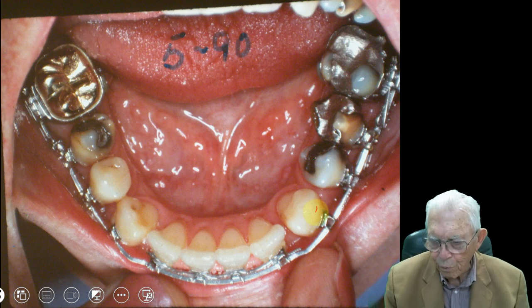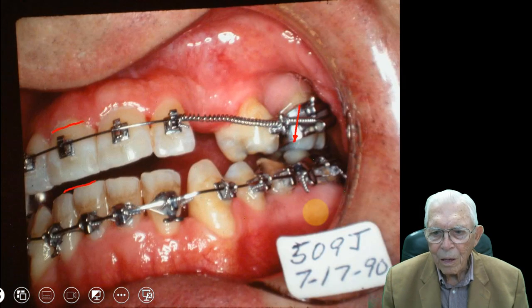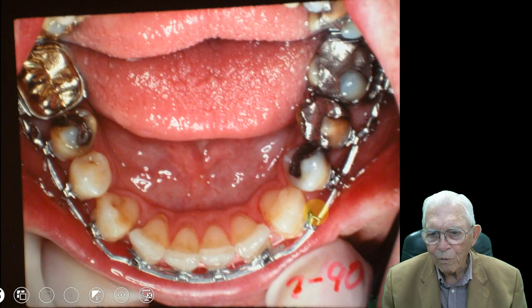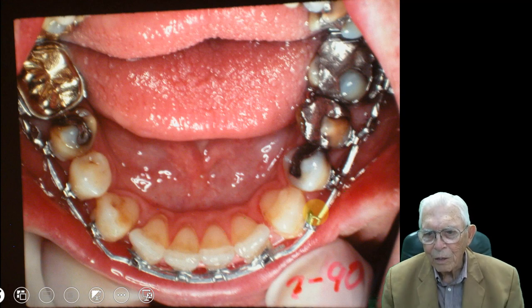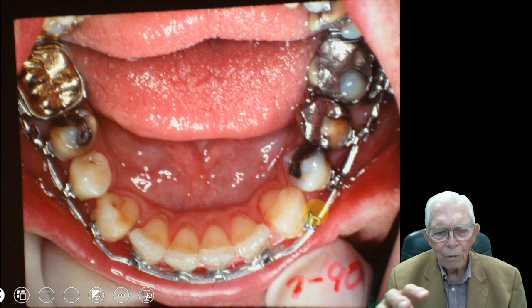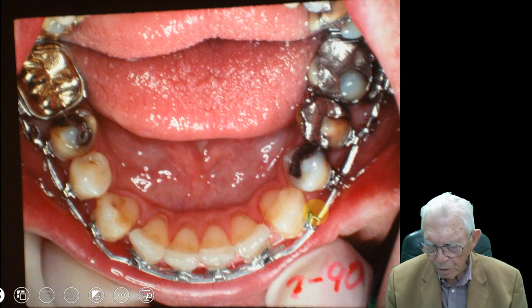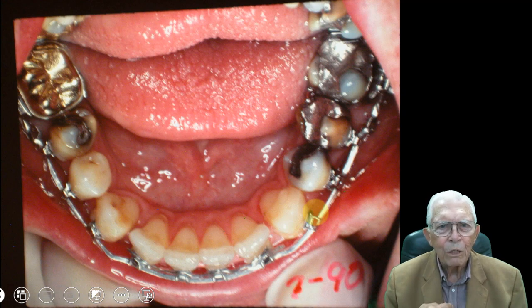We've got to rotate these teeth — they're rotating. We get him leveled out. I'm going pretty fast here, but you can go back and look at it and see how you do it. When you see something done, you know that you can do it. If you were given a case like that and had never seen anything done like it, you'd be afraid to even start it. But you can do this complicated stuff.